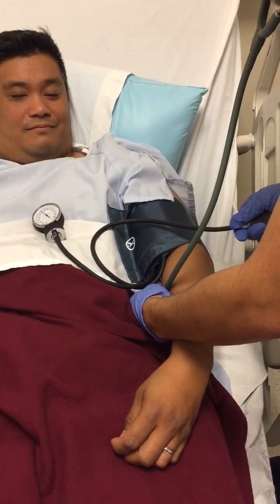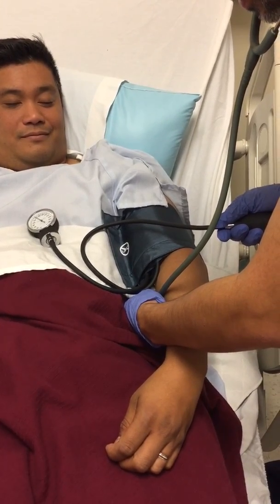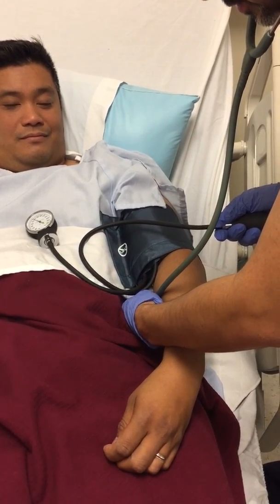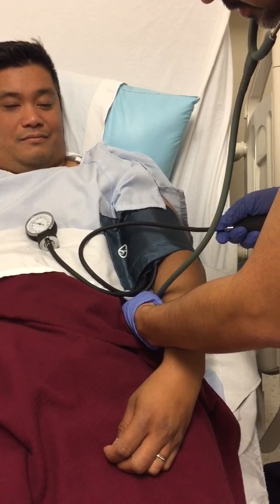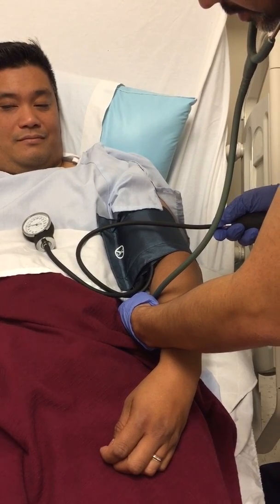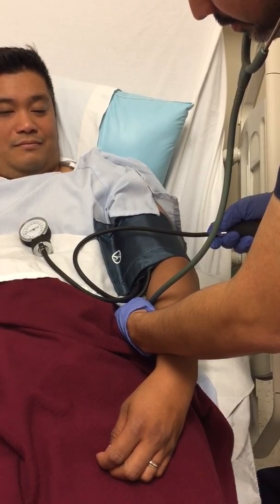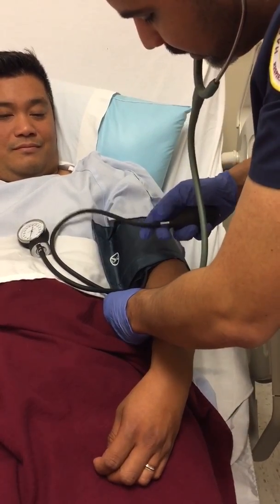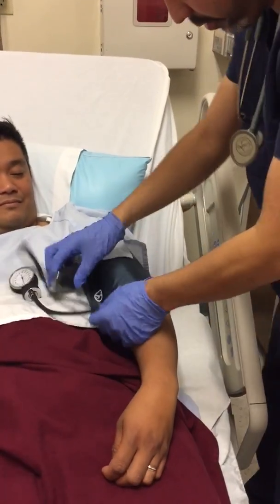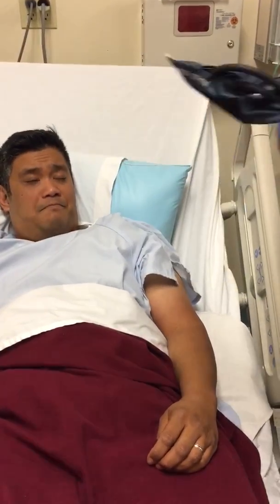I know it feels a little tight. It's pretty good. 124 over 82. Pretty normal. Does that sound pretty normal for you? All right, awesome.